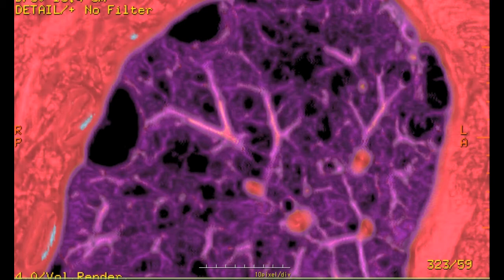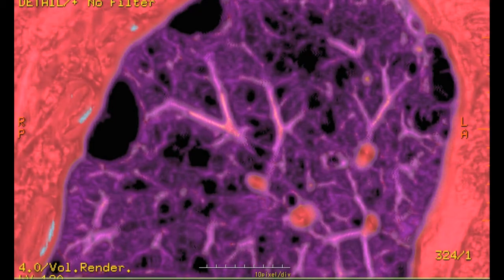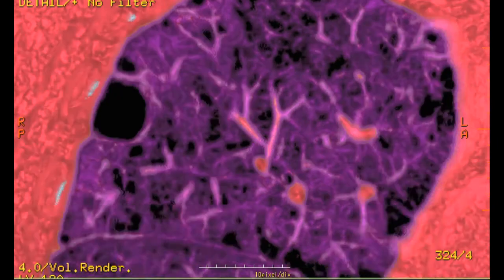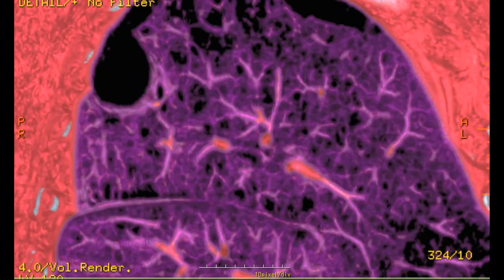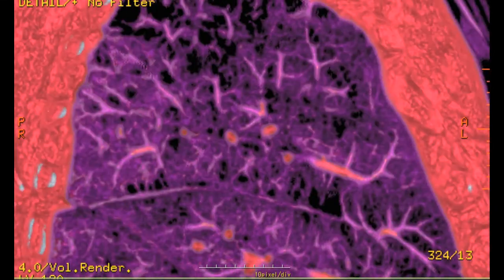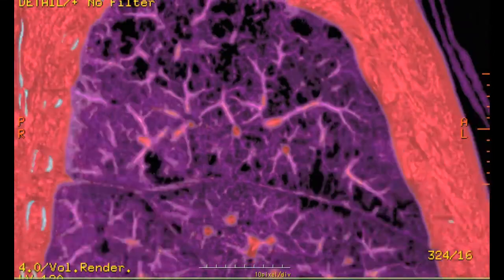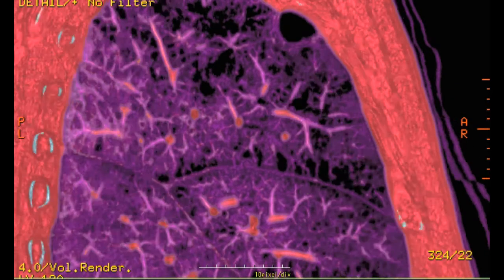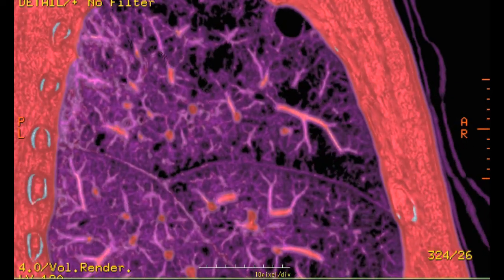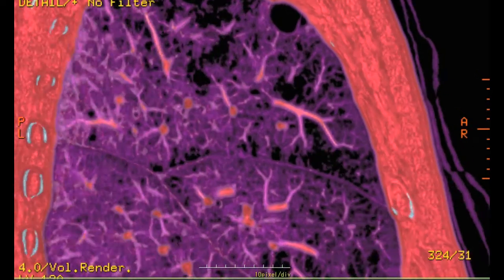Next, turned from coronal view to sagittal view. It shows the horizontal fissure and oblique fissure of his right lung.